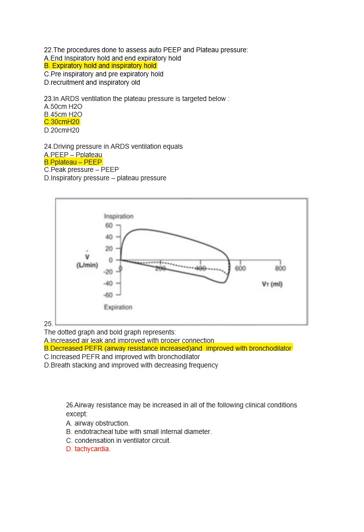So coming to the next question, the 24th question. Driving pressure in ARDS ventilation equals. So the answer is the difference of P plateau and PEEP. So driving pressure is the difference of the P plateau and the PEEP.